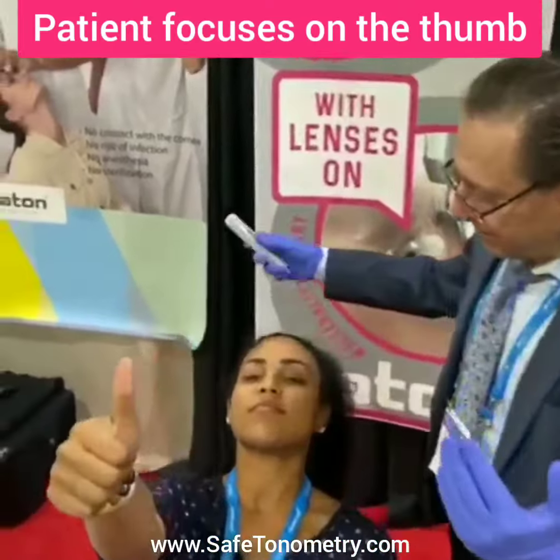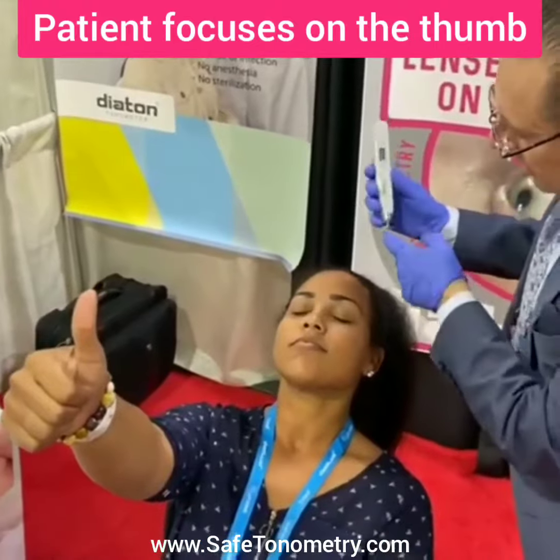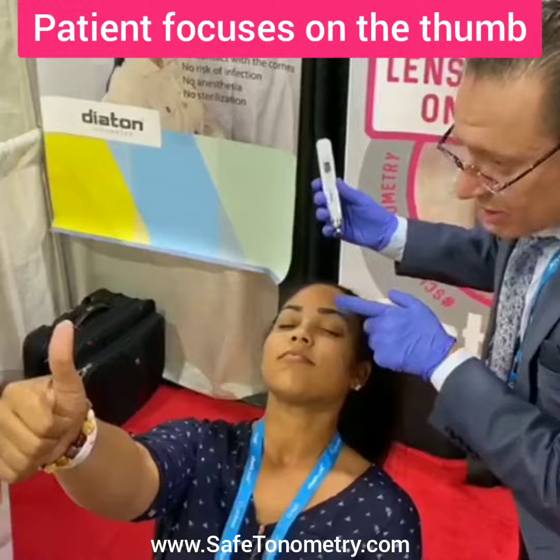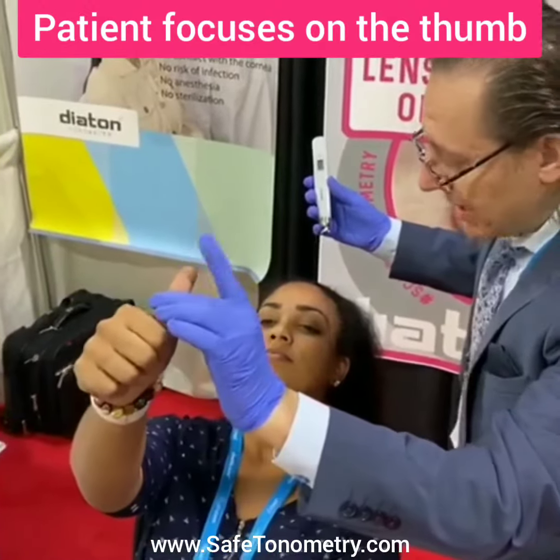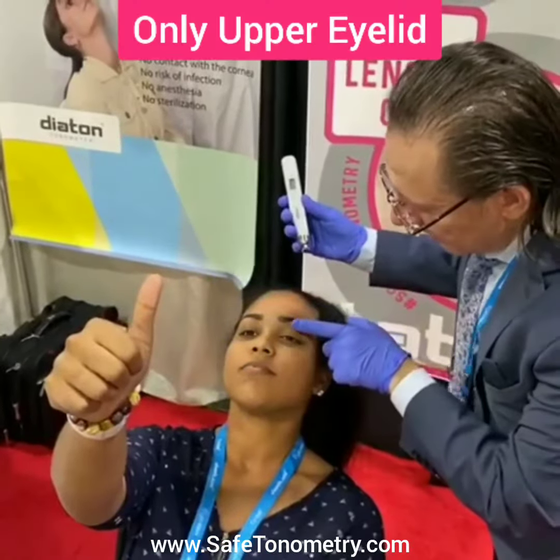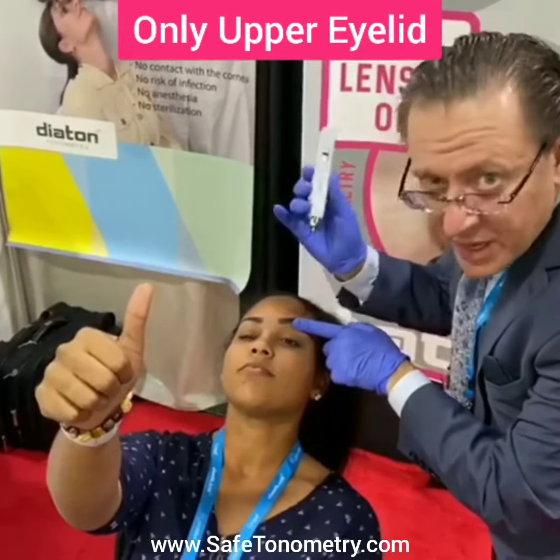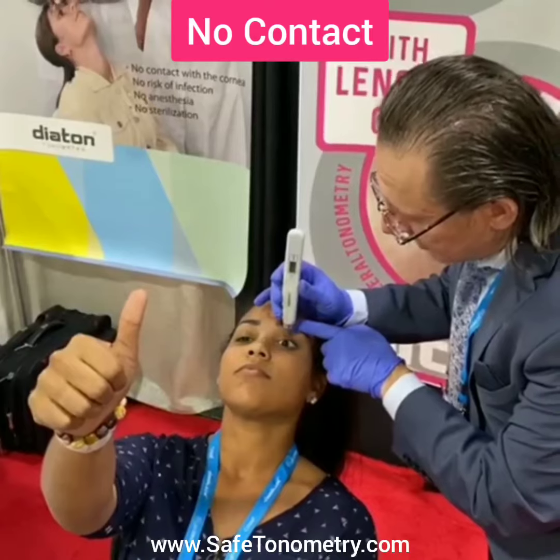Come a little closer. So this is the finger that gently comes in contact with the patient's eye. So I would ask the patient to look at the finger. Gently pull on the lid. Use the edge of my palm for support. Yet again, I'm wearing a glove. I'm not touching the patient.